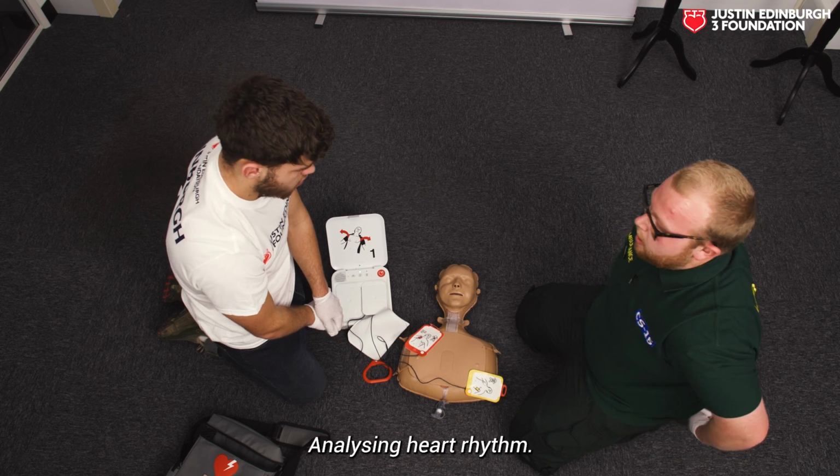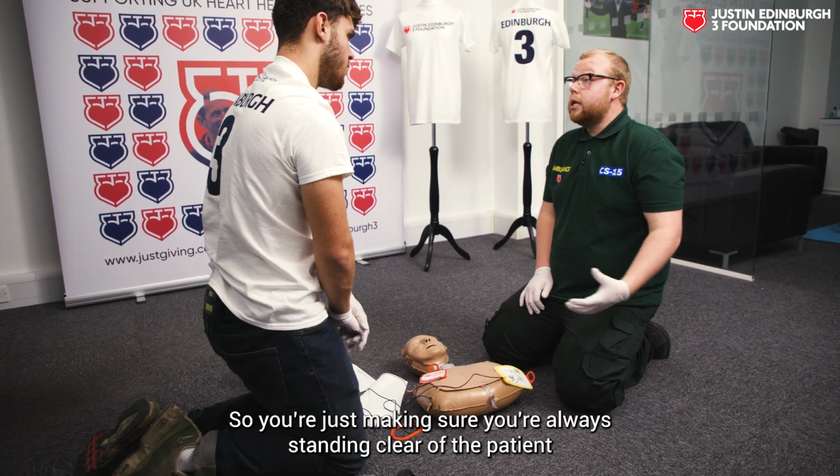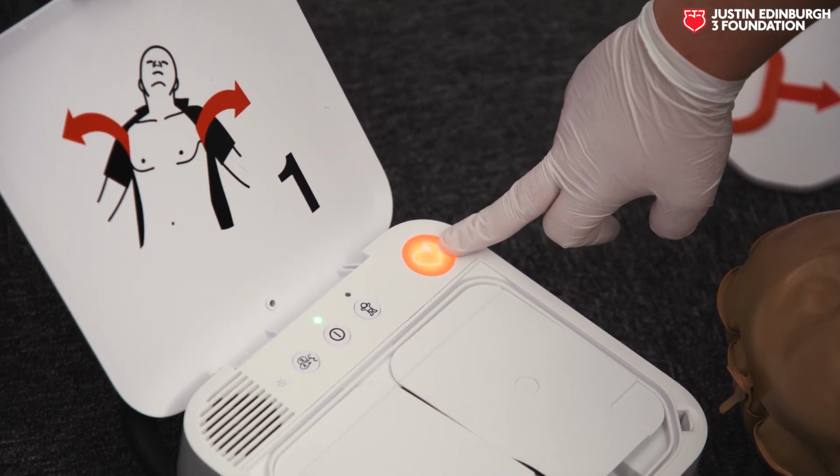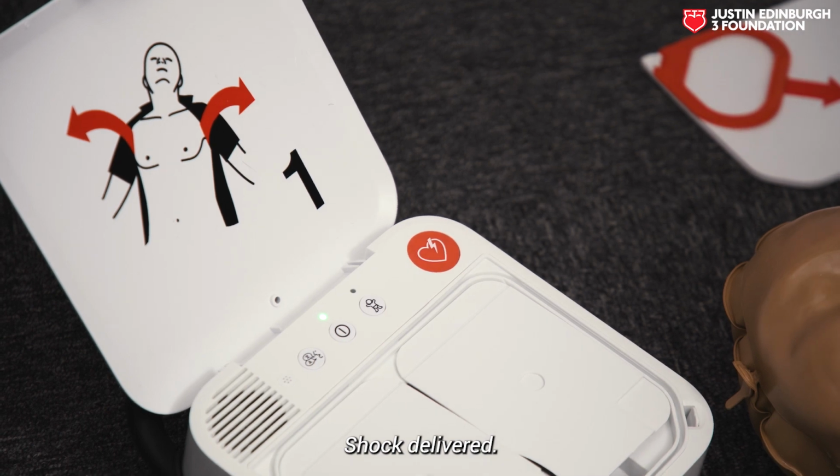Analyzing heart rhythm. Everyone clear. So you're just making sure that you're standing clear of the patient, and then you can deliver your shock. Press the flashing button. Shock delivered.